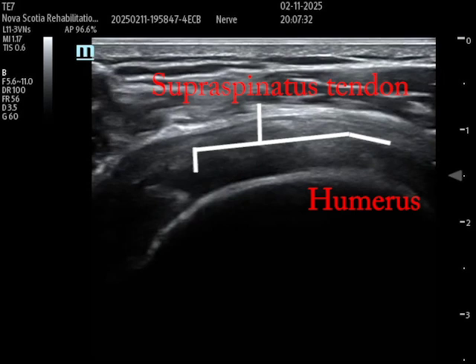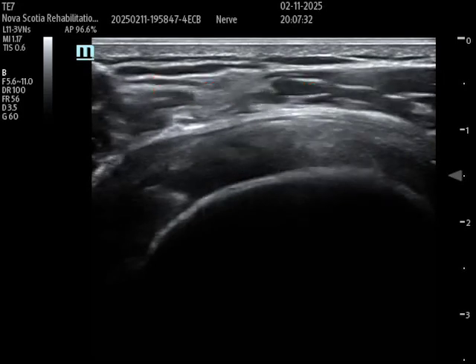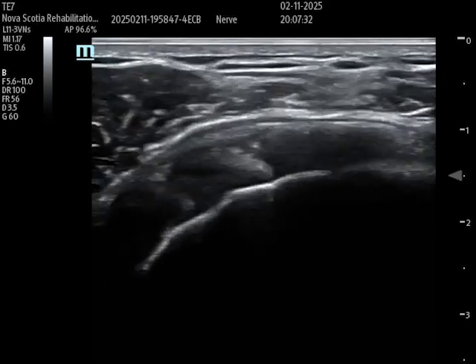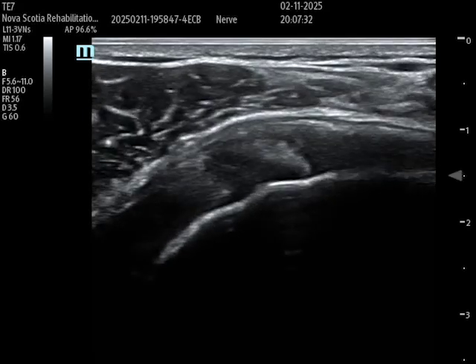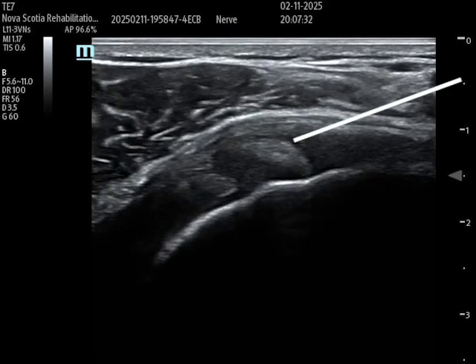I've also marked the underlying humerus. The goal with the ultrasound is to find that long head of the biceps tendon and the bicipital groove, then move proximally — it should lie between the supraspinatus and subscapularis tendons with the overlying coracohumeral ligament. Here I'm moving back to that biceps tendon and the coracohumeral ligament. When I do my injection, I want to follow the plane of that white line, bringing the needle around the long head of the biceps tendon but under the coracohumeral ligament in that space.